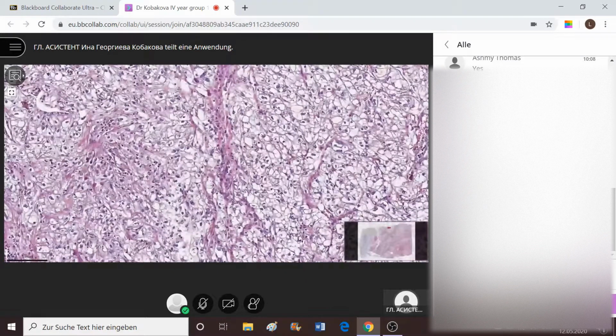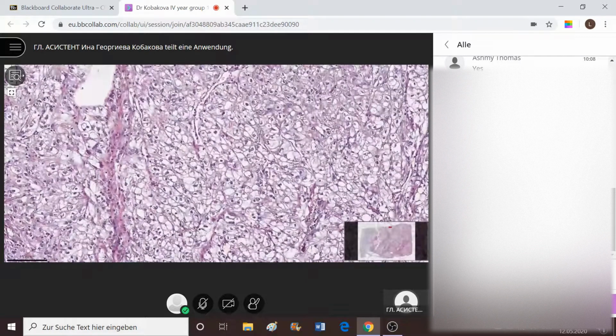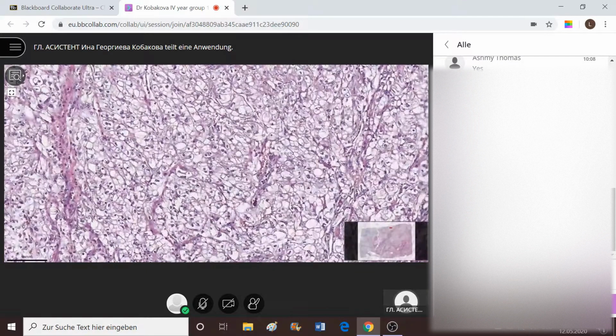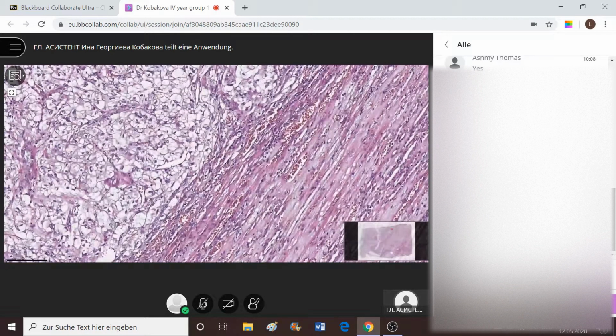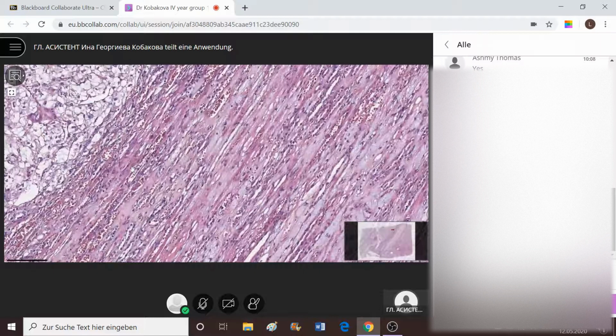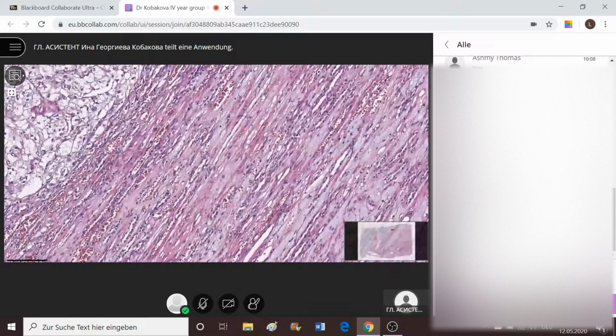The vascular system is well seen, predominant. How the tumor is fed is usually normal for it. The vascular system is more obvious at the capsule of the tumor, which is a fibrotic one. And not much inflammatory reaction is observed here, which is marked as stromal reaction around the tumor, and it's mainly predominated by T lymphocytes, CD3, 5, and 8 type.